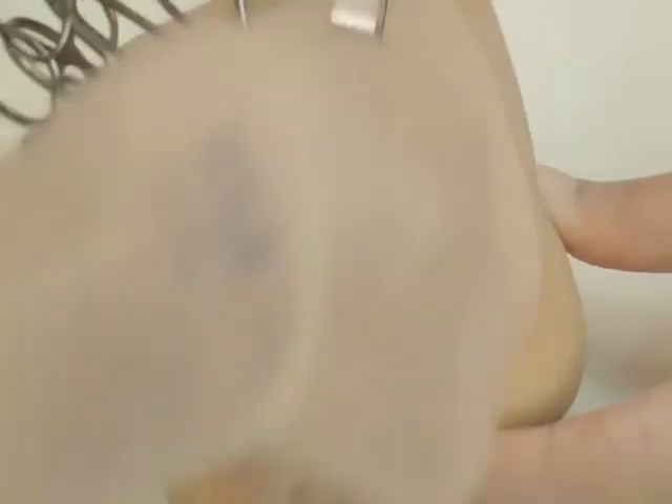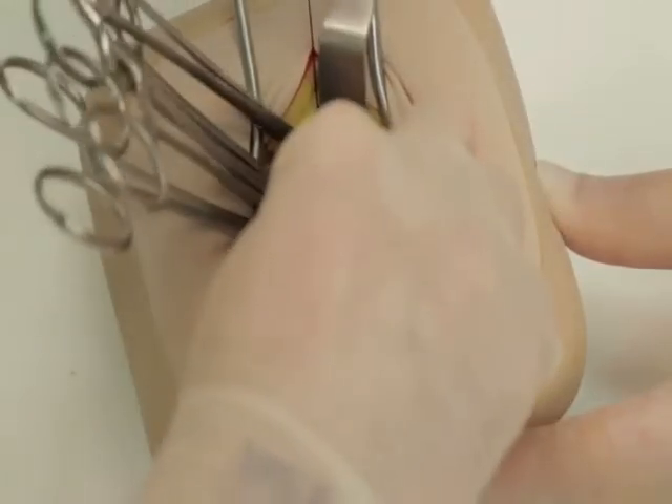The peritoneum is closed using a continuous suture of 2-0 PDS and it may help to place clips on the free edges of the peritoneum.